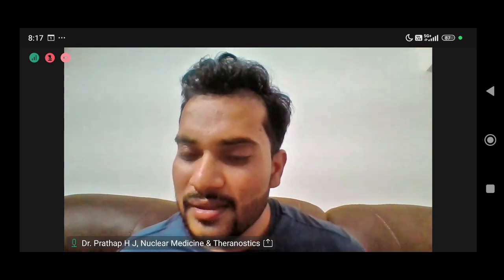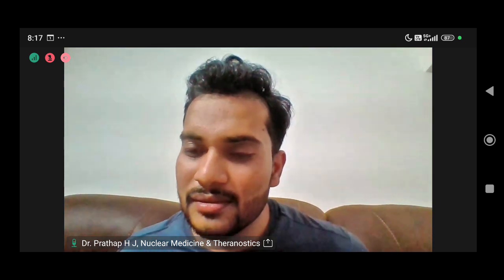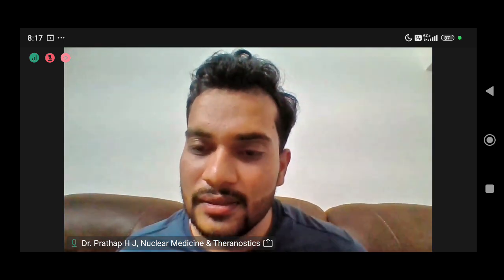What is the reason why PET CT can't be done during the night? With FAPI, we can do it at night also if we have the generator.